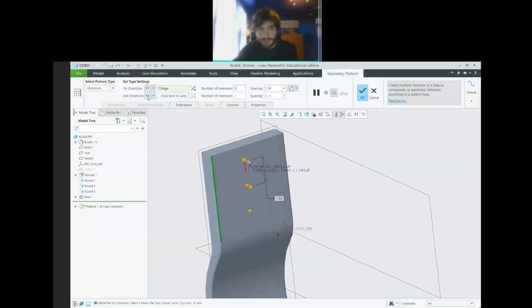If we want, we could create a whole set of rectangles, right? So we click this box to select our second direction, right? We could create a whole separate spacing. Yeah, don't worry about that. So we could also make it a circular pattern with this. We could make it a pattern on a curve. So if we had in a previous sketch drawn some complex curve that we wanted a hole every 1 inch along, right? That's really hard to do. But if we create a curve pattern, you could pretty easily make that feature every 1 inch along some winding curve.